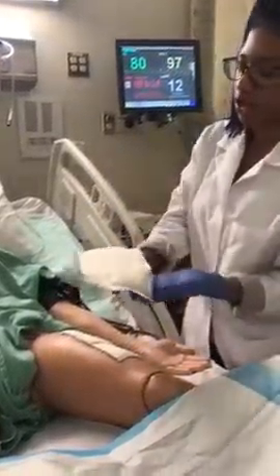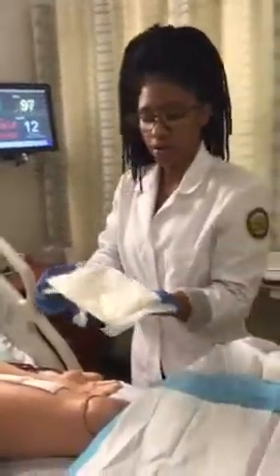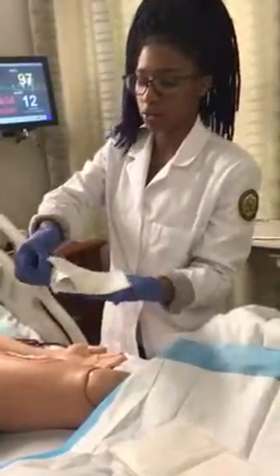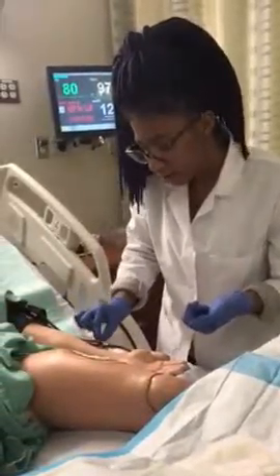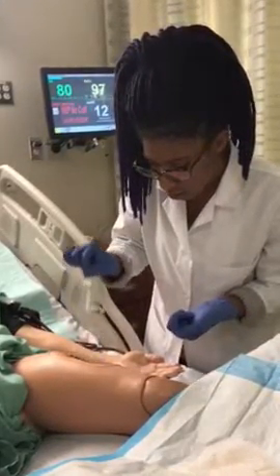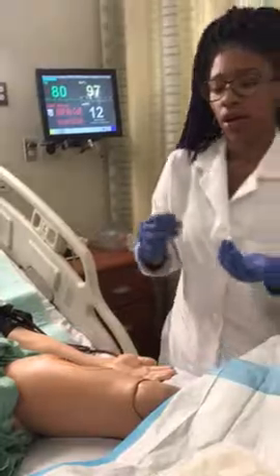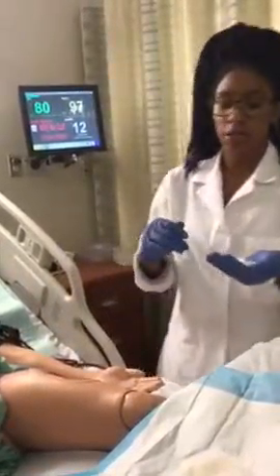When I take the dressing off, I'm going to assess it for amount, type, odor, and color. And I'm going to do the same amount, type, odor, and color for the 2 4x4s as well. And then I'm going to take out the packing, making sure not to touch the edges of the wound. And I'm going to note how many there were used to be packed. And I'm going to note the amount, type, odor, and color of the drainage. And this one fell out, but I will still do the same.